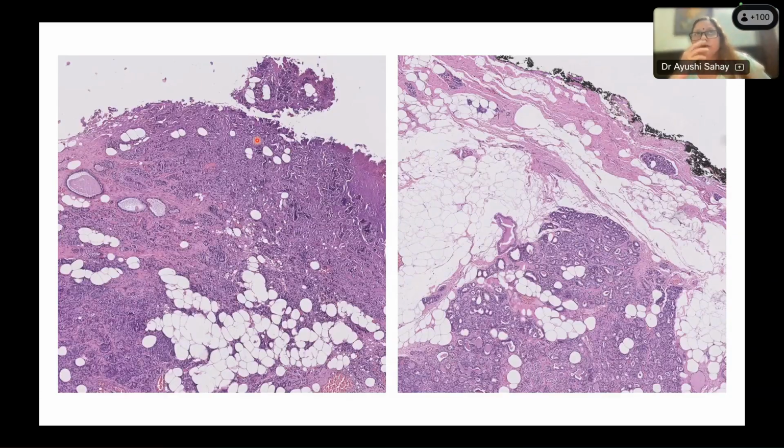No, I think you have covered everything. Microglandular adenosis is another pitfall, which may be mistaken for invasive breast carcinoma, and you have explained it very nicely. I see many participants have called it secretory carcinoma. I can understand because of those secretions, but that doesn't really explain that it is a secretory carcinoma. The morphology and the glandular structure are more diagnostic of microglandular adenosis.